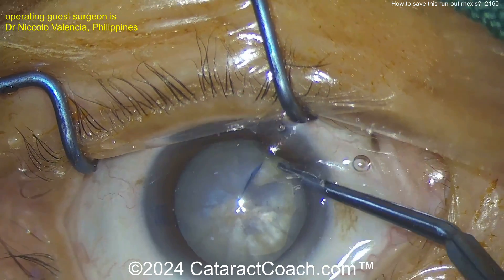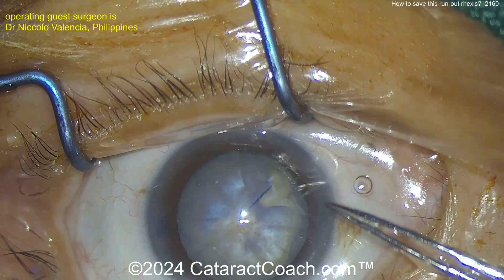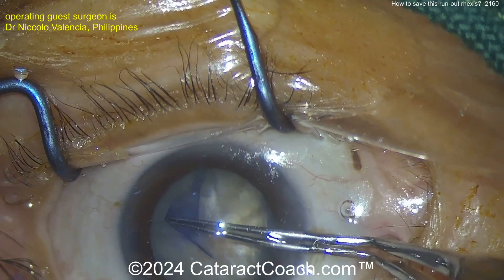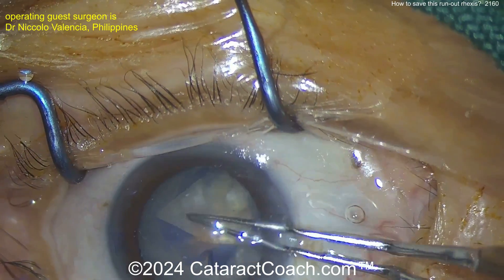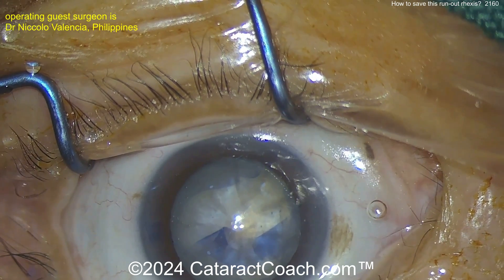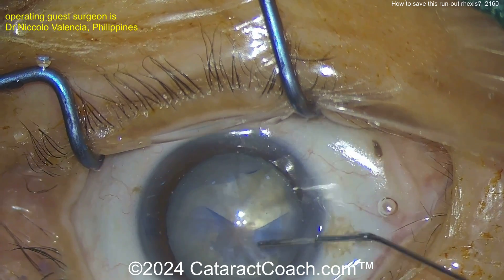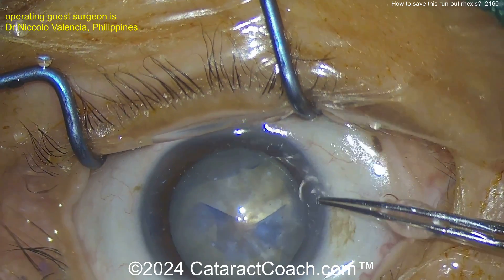So what should you do? Try the Little maneuver. If it doesn't work, you may just have to go around the other way and have this one weak spot. Cutting with micro scissors is good too — a little nick there in the capsule with the micro scissors, and continuing. Just keep in mind you've got this one weak area now.